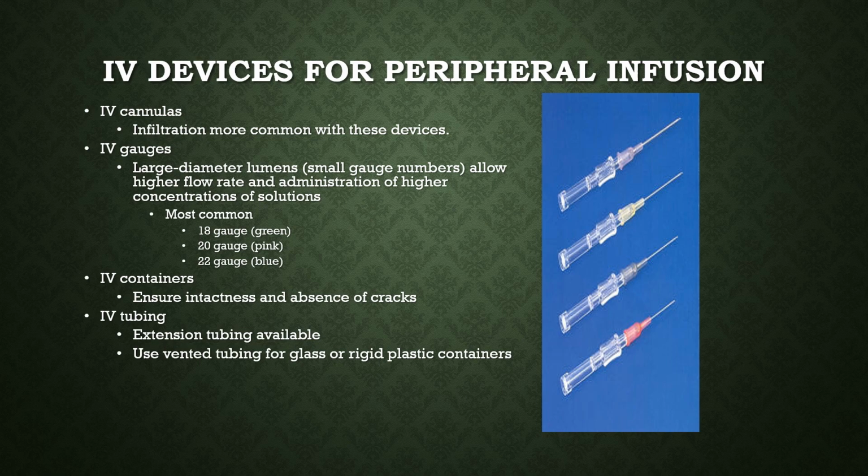in order to be comfortable that your line is not going to clot off. Okay, so you can put different size tubes into a vein, for lack of a better word, tubes, cannulas, whatever you want to call them, based on what your needs are. Most of you probably know this. When you put in an IV, you use a needle to stick the patient and put the IV in. On the outside of that hollow needle is a hollow plastic cannula. Once you get in the vein, you pull the needle out, and what's left in the patient is a little plastic hollow cannula.